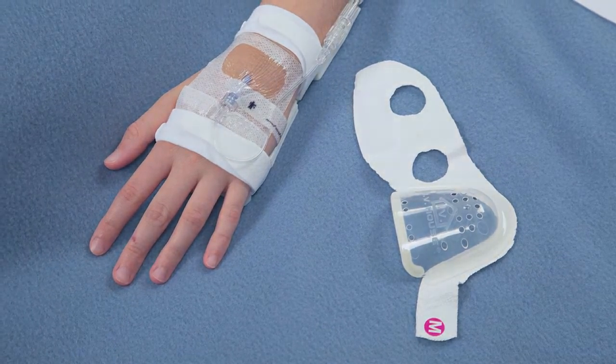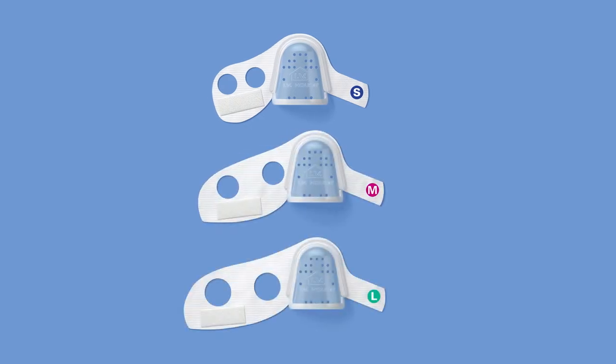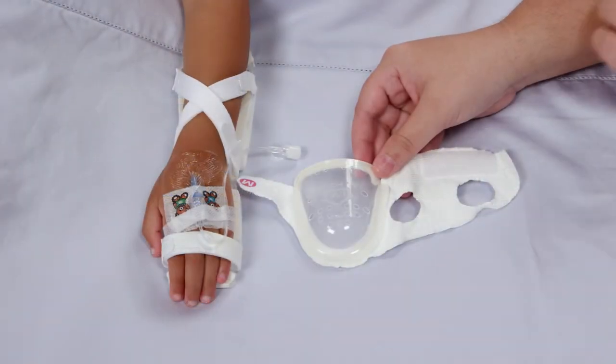The IV House UltraDressing comes in three sizes for the hand: small, medium, and large, plus a one-size-fits-all model for the arm that accommodates an extra-large hand.